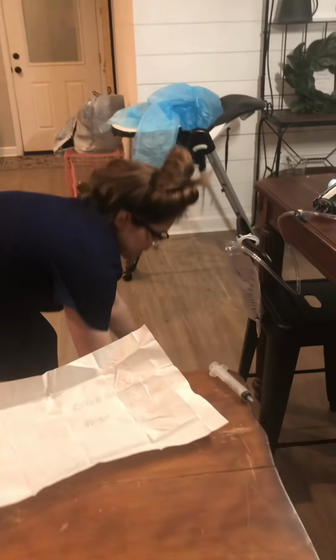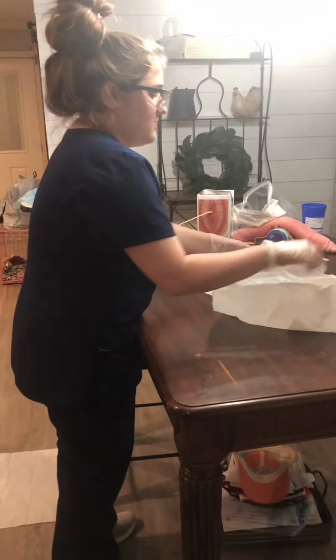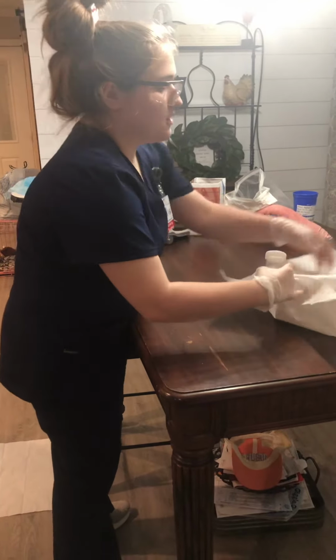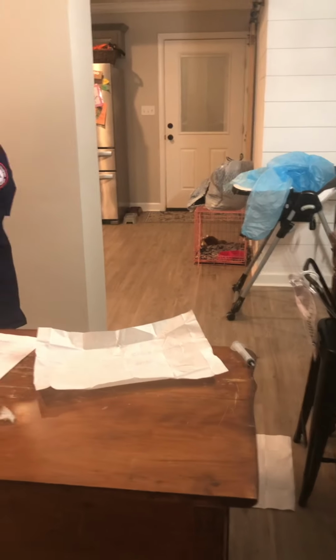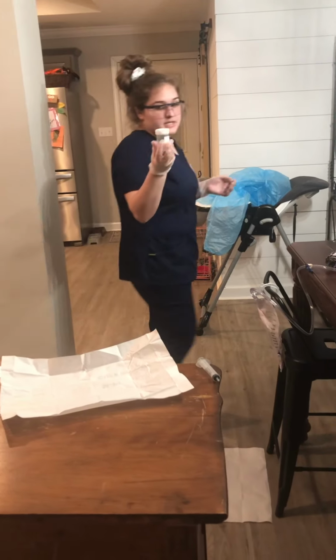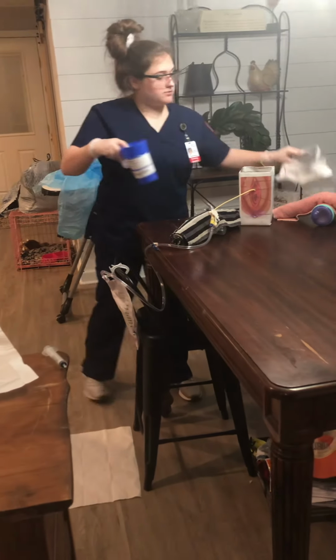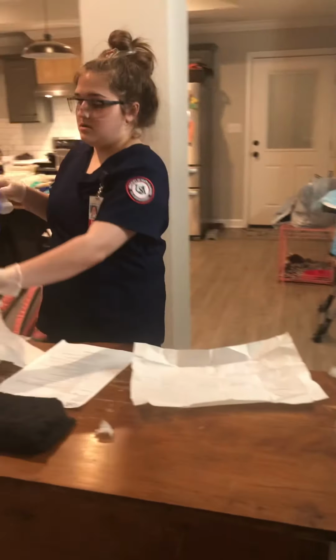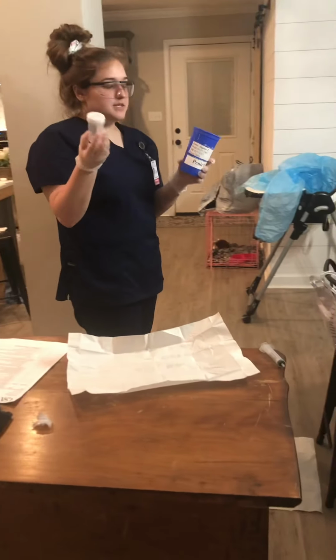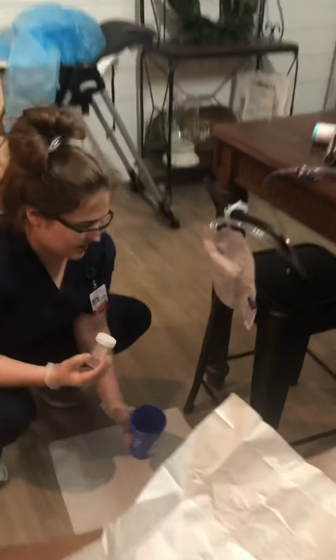I'm just gonna show you how I get a specimen. Before I did that though, I'll clean up my area. I'll clean up all this and discard. I'll throw it in the trash can, but for now I'm just gonna sit it right here. So I would get my specimen container, and I would also throw away this trash bag as well. So I have my specimen container and a graduate cylinder. So I'm going to put it down on the ground.